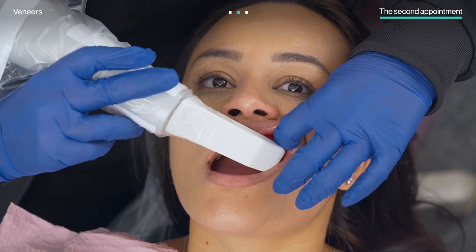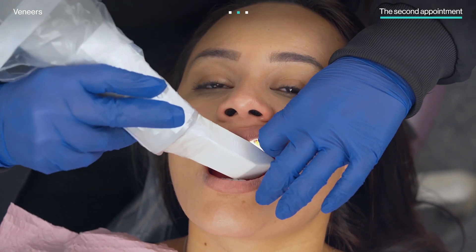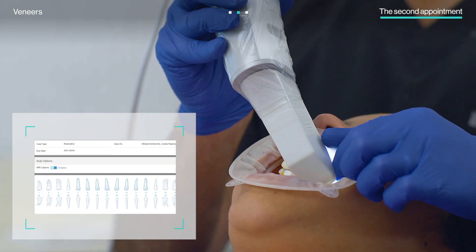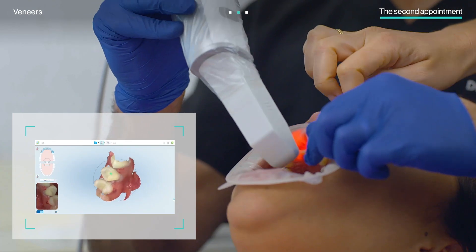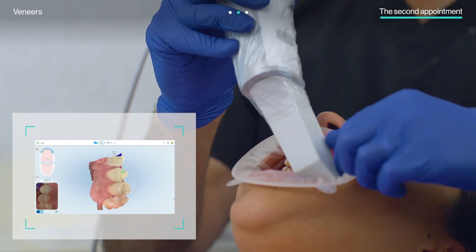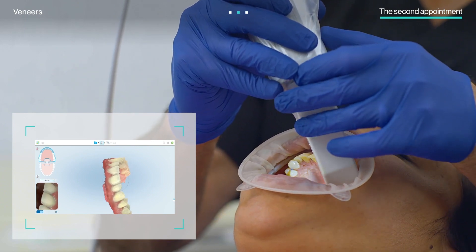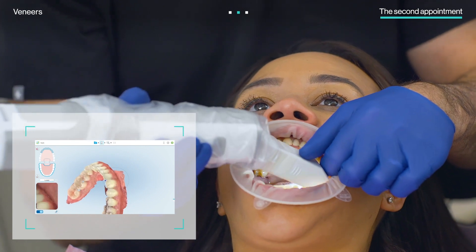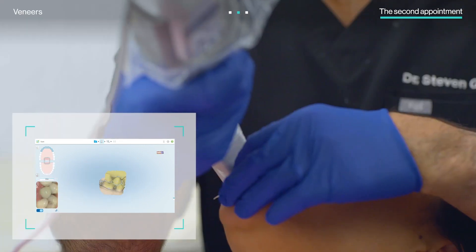After finishing the teeth preparation, he proceeded directly to the iTero scanning protocol. He created a new prescription to scan the preparation, including the individually prepared teeth, the prepped arch, the opposing arch, and the bite.